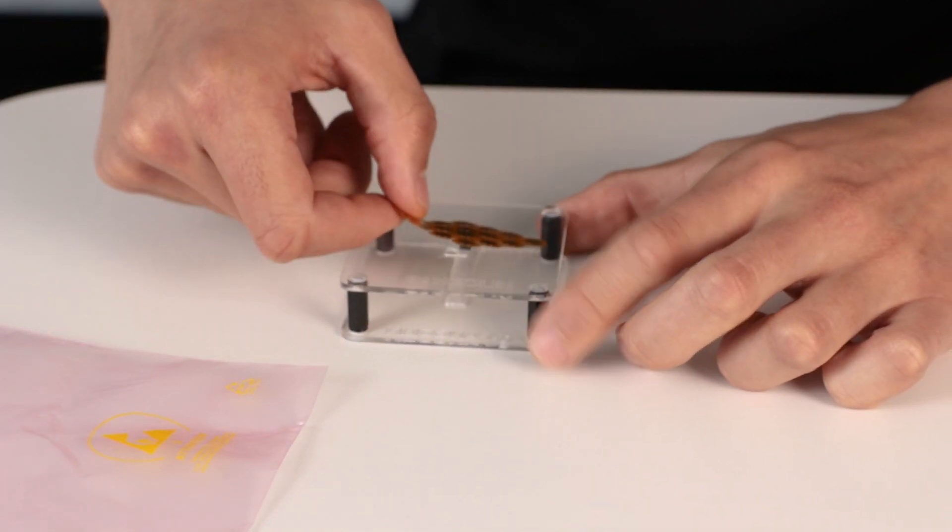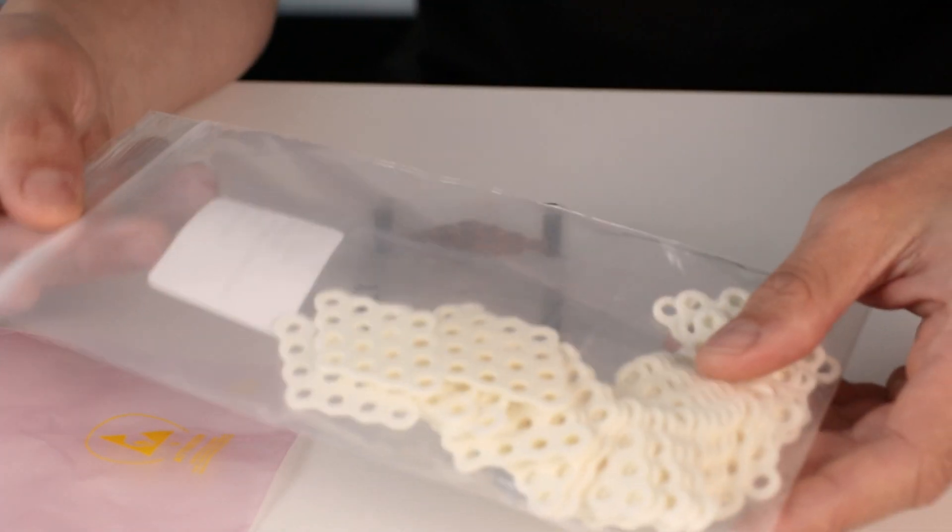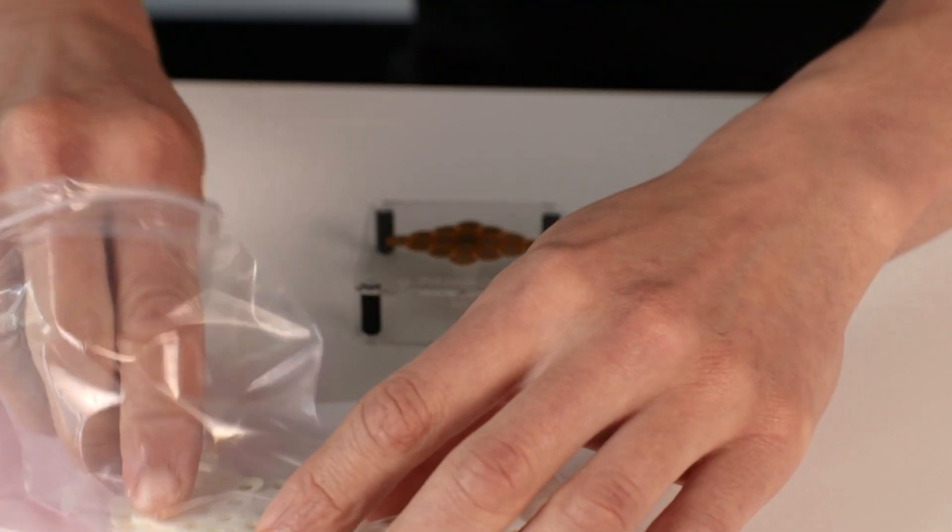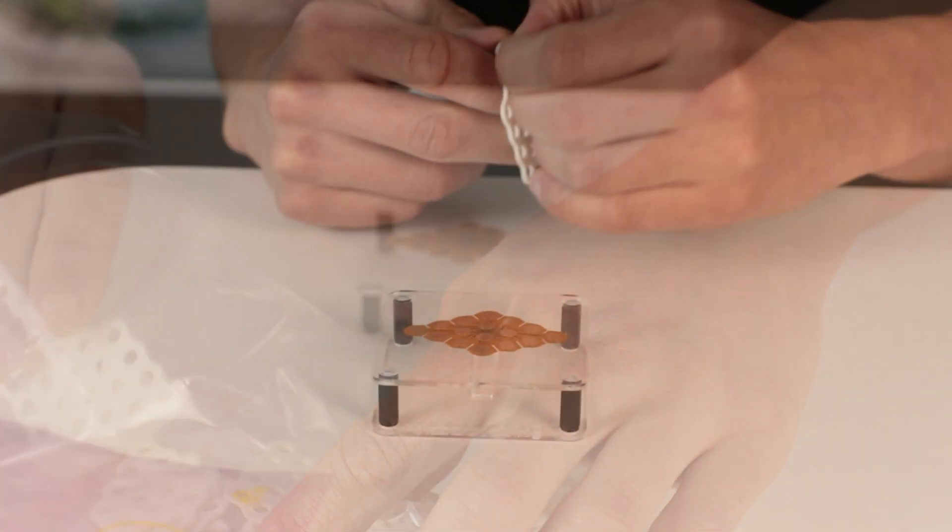The first thing we have to do is place the adhesive that will stick to the skin onto the grid. So you take a new adhesive, slip it off like this.